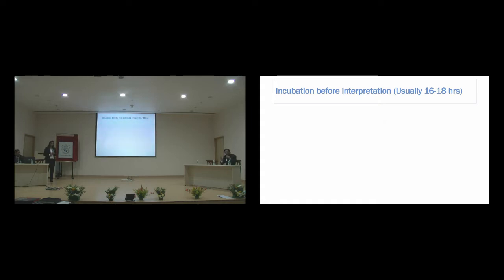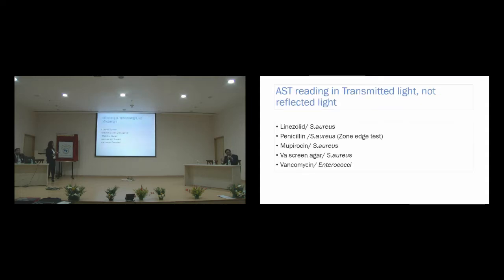The standard recommendation is you should look at the plate with the unaided eye in reflected light, not in transmitted light or with lenses, except in situations where the resistant phenotype organisms are known to be slow growing. Otherwise, in all other situations, we should not be over-enthusiastic and try to make it more sensitive. Thereby we will probably misinterpret the results.